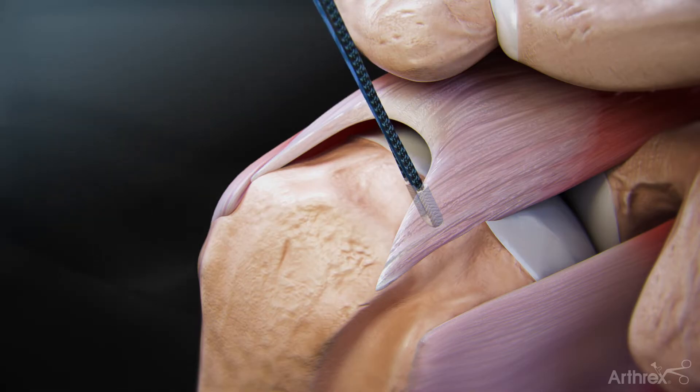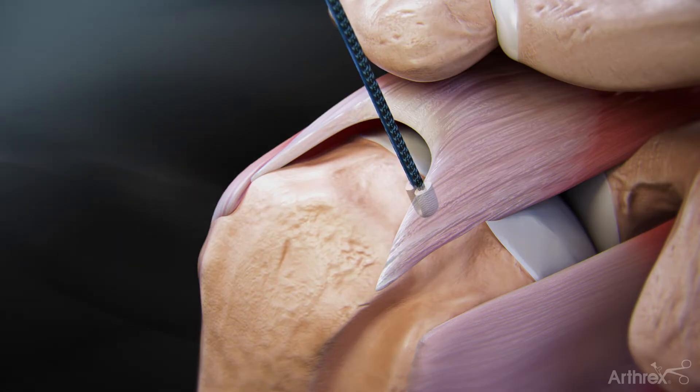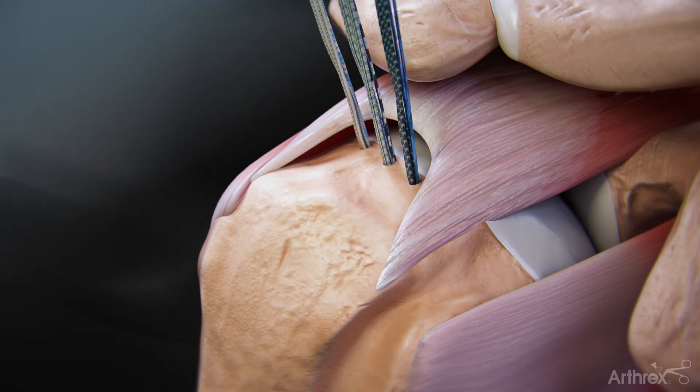Once the anchor is fully inserted, remove the inserter. Grasp all limbs of the sutures and pull slightly to set the anchor. Repeat these steps for anchor insertion for the middle and posterior anchors.